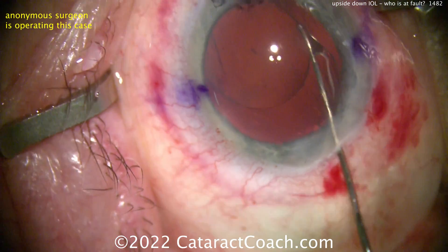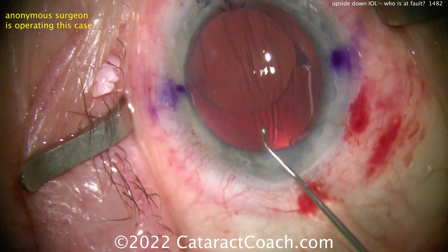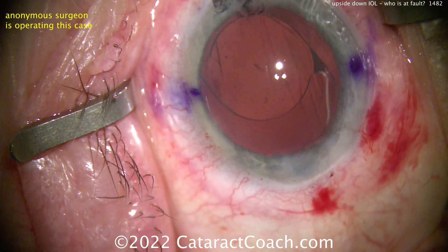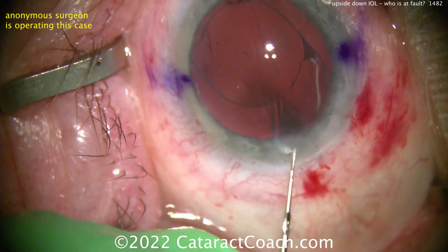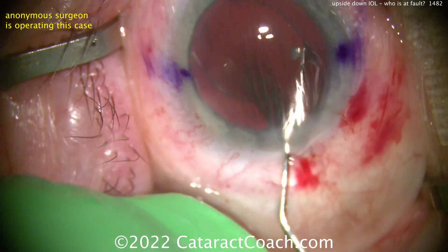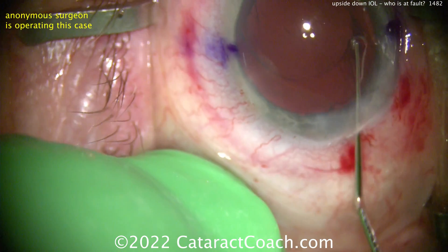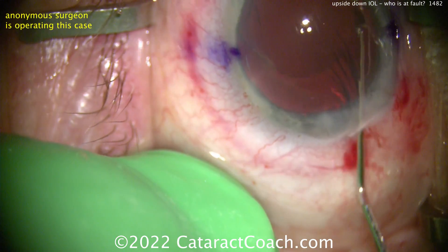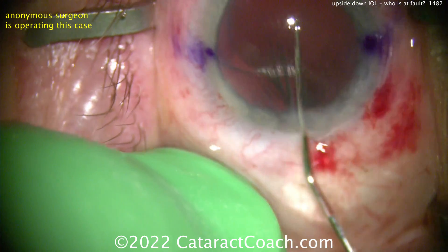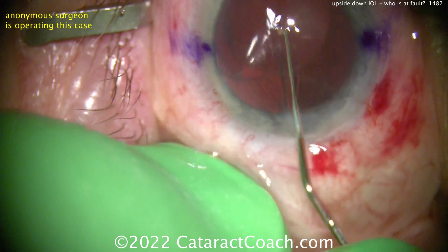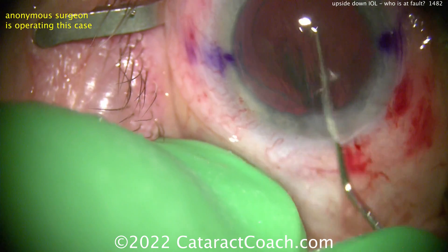Looking here, the lens is going to go in the eye. My advice is to pull one haptic out of the eye — pull that haptic right there out — fill the eye with copious amounts of viscoelastic to really create some space, and then with one haptic outside the eye it's a lot easier to get it flipped over.